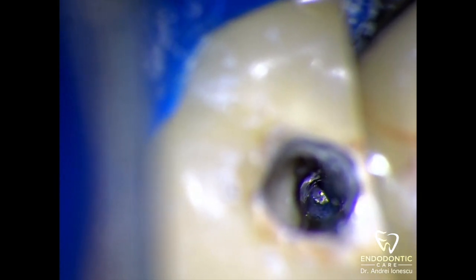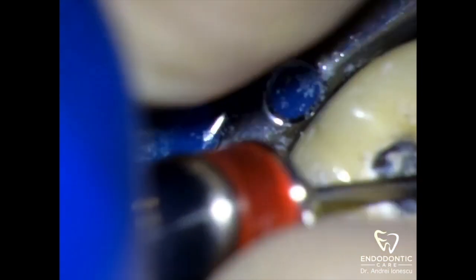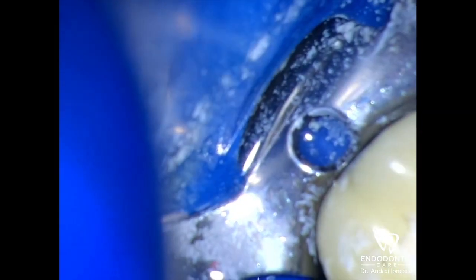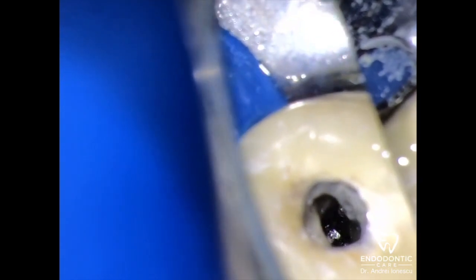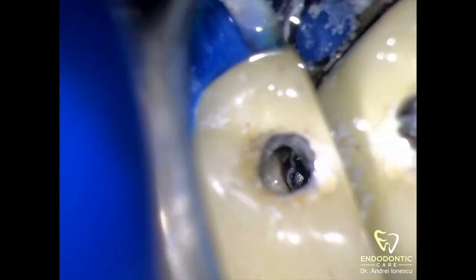We're going to move on to the IRS system now. The first step is to select the appropriate IRS core drill — this is trial and error, so you try them in and see what works. In our case the red core drill was ideal. It fit nicely over the top of the head of the separated instrument, and in a clockwise watch-wind motion you rotate the core drill until you create enough space around that file that you can grab onto it with the next part. I'm not fast-forwarding through this part so you can get a sense of how long it takes to create this trough. I still don't think I have enough file exposed, so I'm going to go back at it one more time with the core drill.